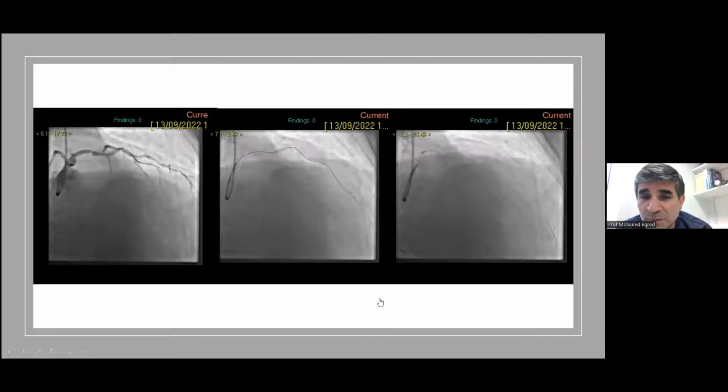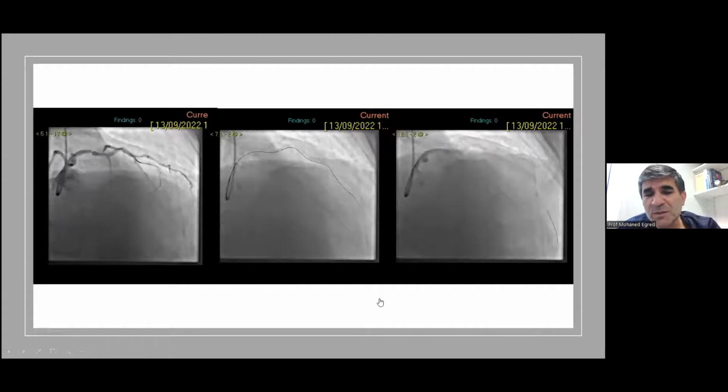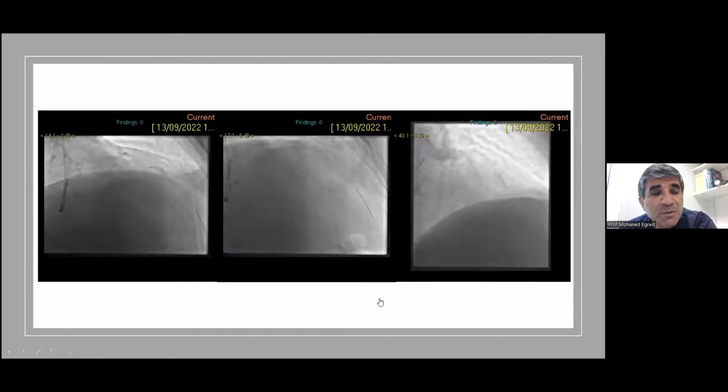Number one, it's stiff. I don't want any problem distally, particularly when, with any resistance, the wire could move back and forth. And also because of the radio-opacity, it makes it difficult to see what lesion you're dealing with on the artery. So the Gladius MG went distally. And now that struggle became more relevant because I could not deliver any balloons or any equipment. The proximal lesion needed to be treated with a high pressure non-compliant balloon. And despite that, it was still tight, but I managed to get a guide liner down. The plan was to take a laser catheter because I didn't think I was able to put any rotablation down.